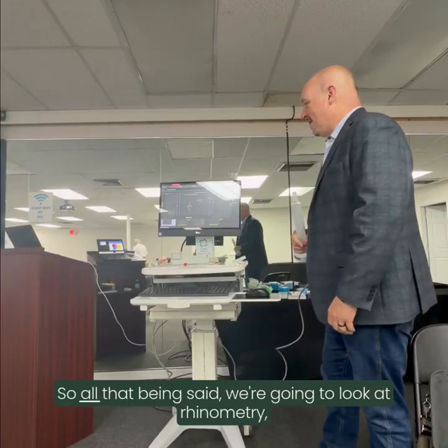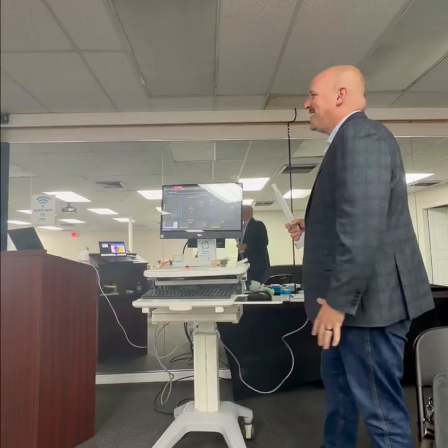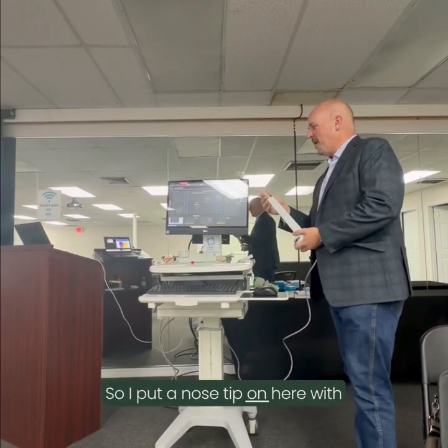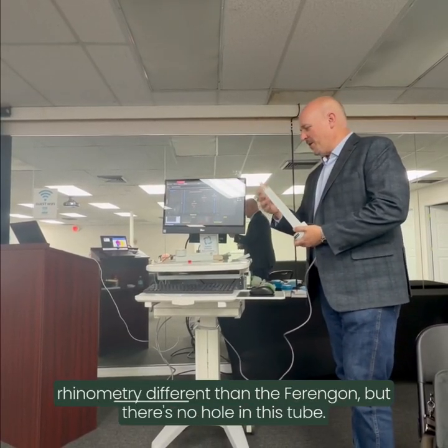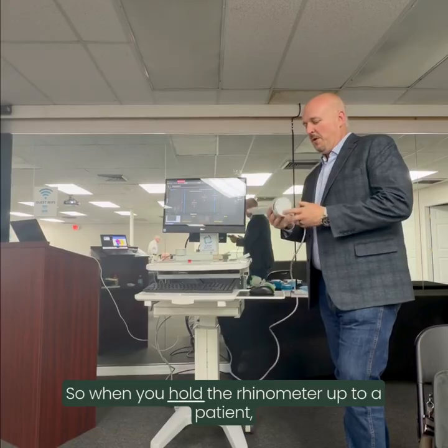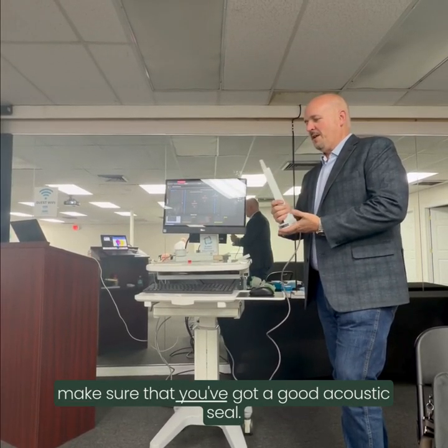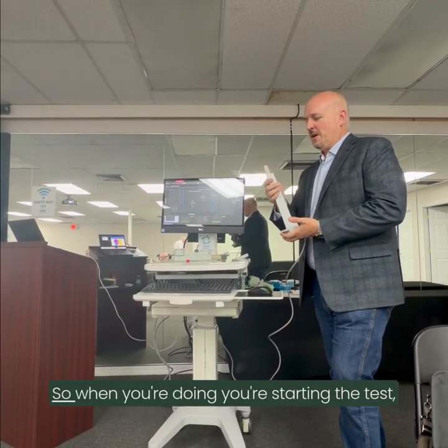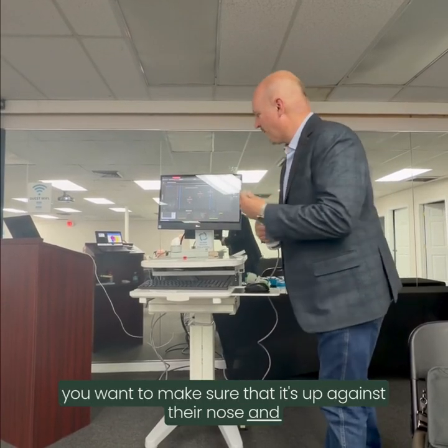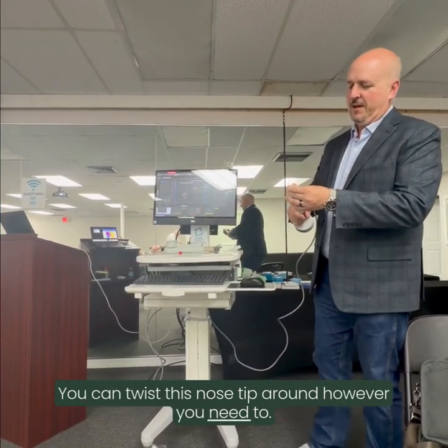So, all that being said, we're going to look at rhinometry, which has nothing to do with collapse. Rhinometry is real easy. So I put a nose tip on here. With rhinometry, different than the pharyngometer, there's no hole in this tube. So when you hold the rhinometer up to a patient, the first thing you want to do is make sure that you've got a good acoustic seal. When you're starting the test, you want to make sure that it's up against their nose. And I'll do my left side first.